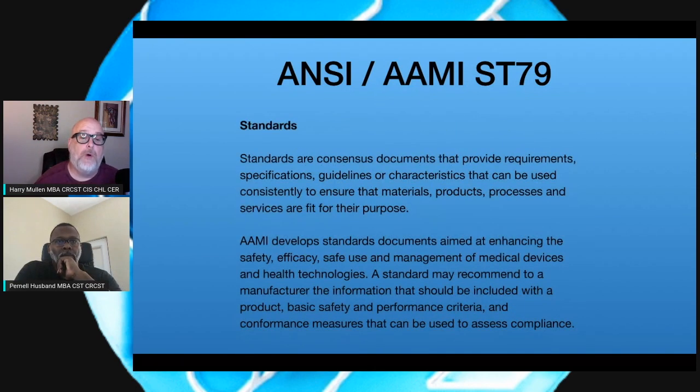All right, so the first one we have are standards. Now, standards are consensus documents that provide requirements, specifications, guidelines, or characteristics that can be used consistently to ensure that the materials, the products, the processes, and the services are fit for their purposes.